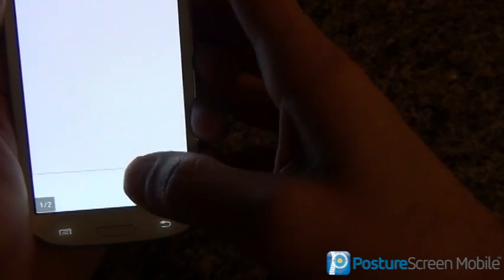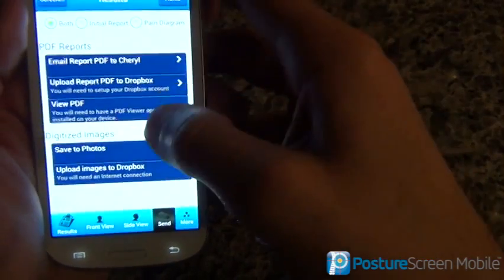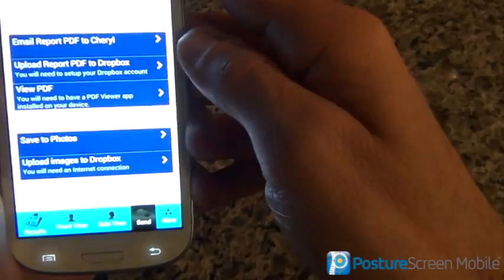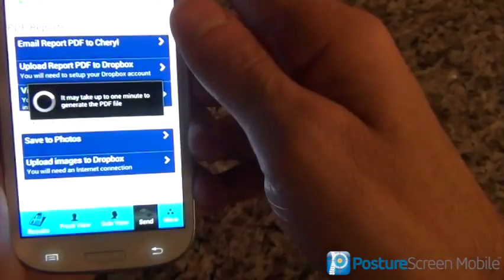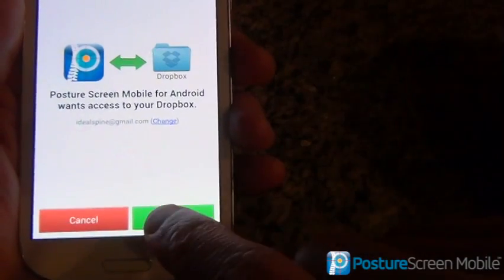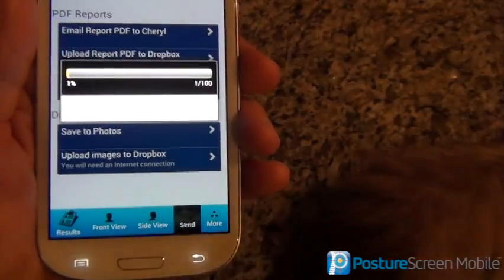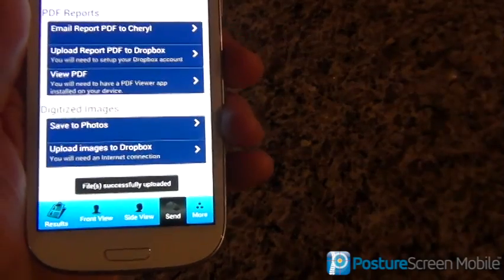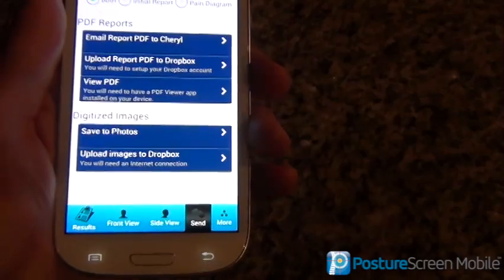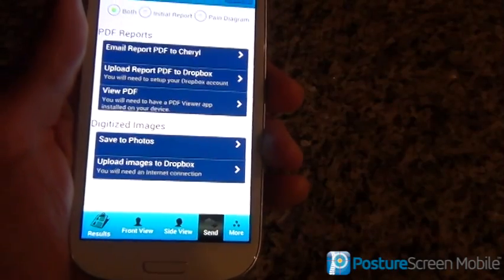I'm going to go ahead and hit the back button on the S3 and go back into our program. There's the program — if I want to save the photos, we can save them to the camera roll, and we can upload those images to Dropbox as well. The first time, it's going to ask to allow — you do this just one time and then it will upload everything into Dropbox. For more information, please browse to postureanalysis.com or email us at info@postureco.com. Thank you.